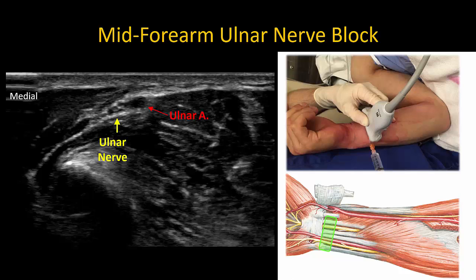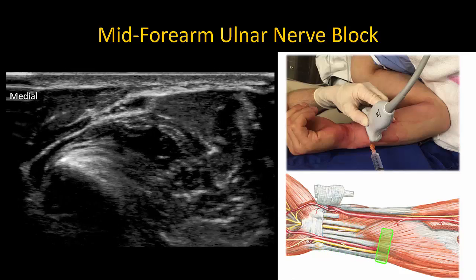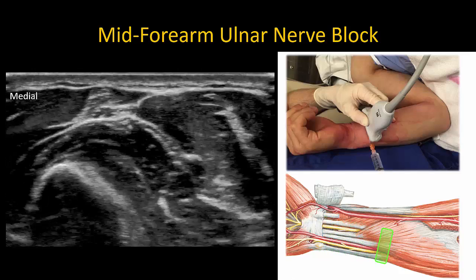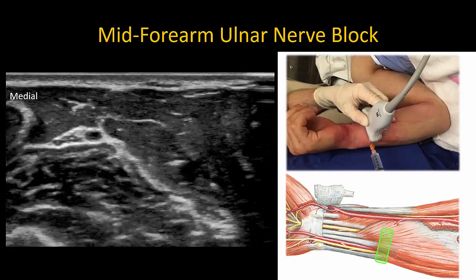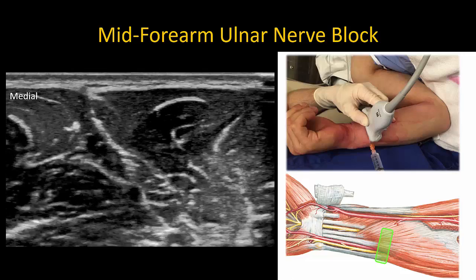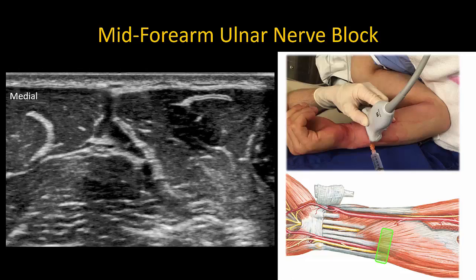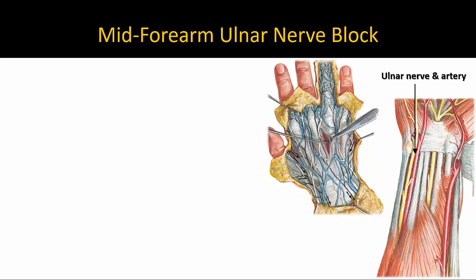With the arm in the same supinated position, the ulnar nerve is most easily identified by placing the probe close to the wrist crease over the ulnar artery. The ulnar nerve is always located immediately adjacent and medial to the artery. Both nerve and artery can be traced proximally to the upper forearm where they separate from each other. The nerve may be blocked anywhere in the lower half of the forearm as long as it is proximal to the takeoff of the dorsal cutaneous branch and the palmar cutaneous branch.